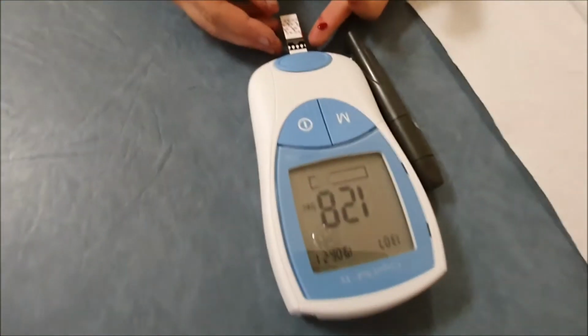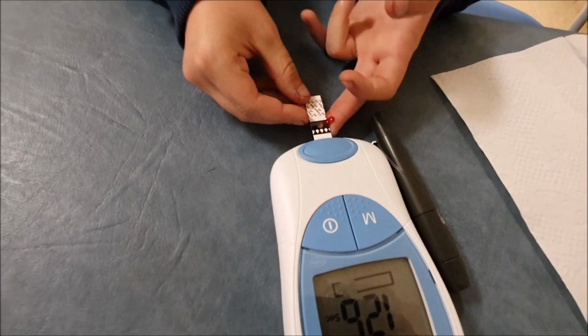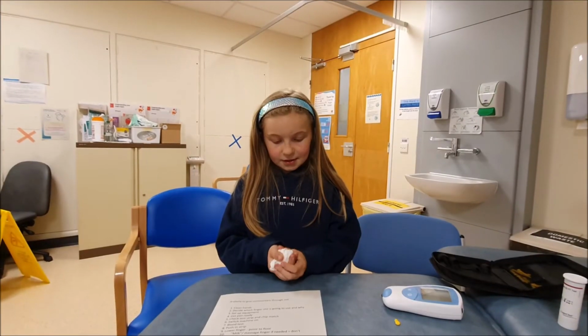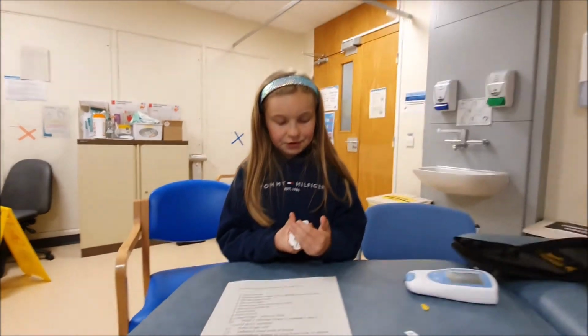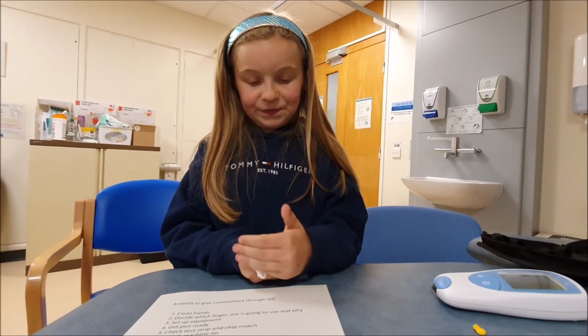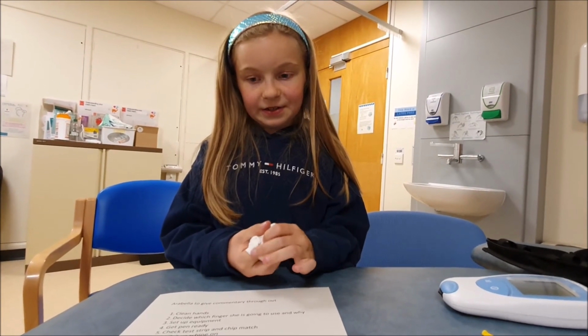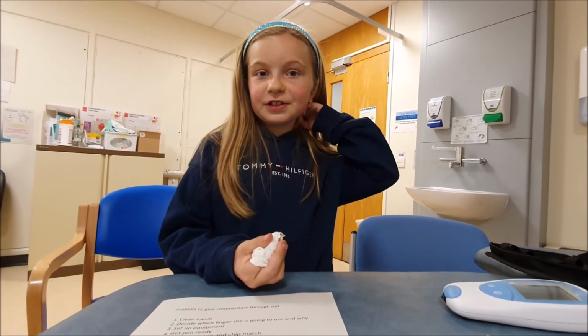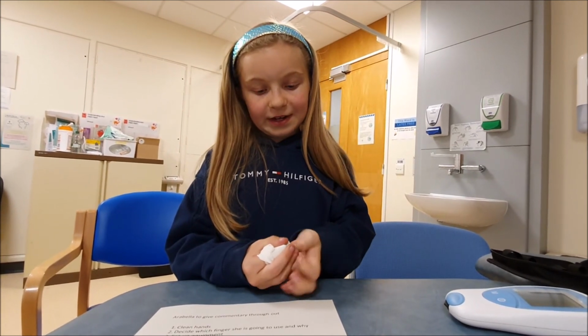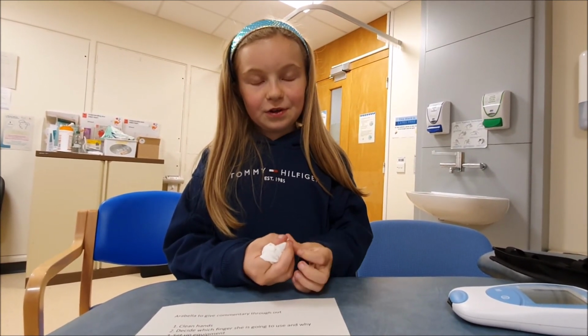So once you have enough blood, then go and put it like that. So get a bit of tissue or any cotton or anything to stop it bleeding. And then it's good to be able to do it at home because you don't have to come to the hospital for a lot of appointments.